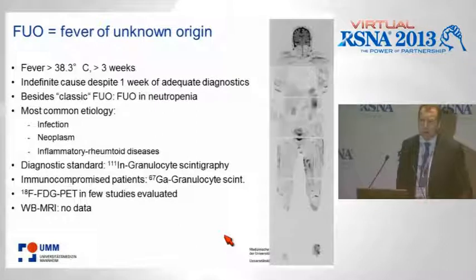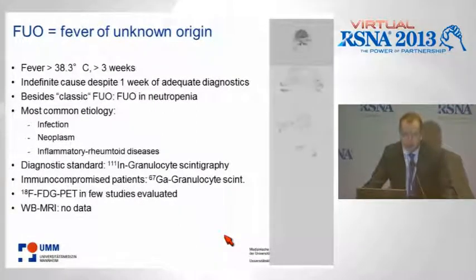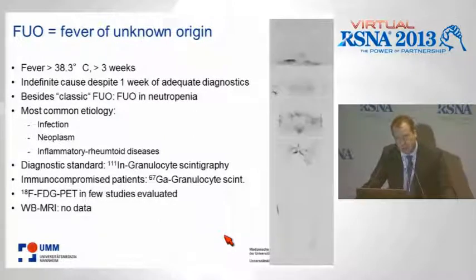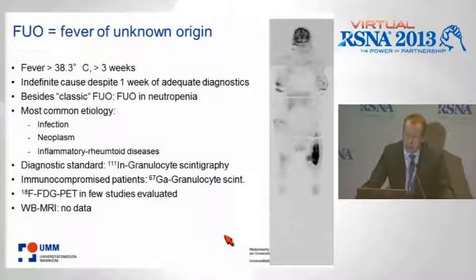Now, my last field, I think, really has also entered the clinical routine. Actually, we start to do this routinely instead of PET in our hospital, because reimbursement in our country is relatively poor. We only get lung cancer reimbursed for PET-CT. So the clinicians love this.